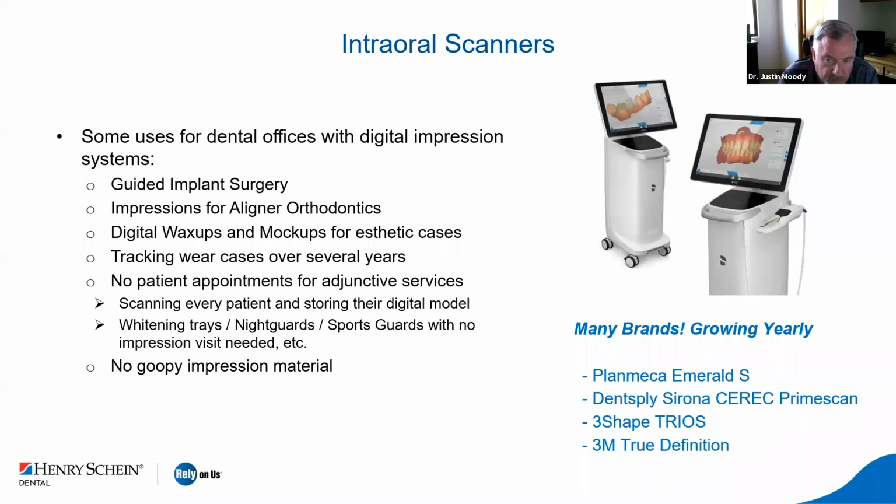I can tell you from my practices, and at the New Horizon Institute, we have 3Shape TRIOS, and we have Planmeca Emeralds. We don't currently have the Sirona CEREC. However, that is an incredible workflow, and it fits in, just like everything else.